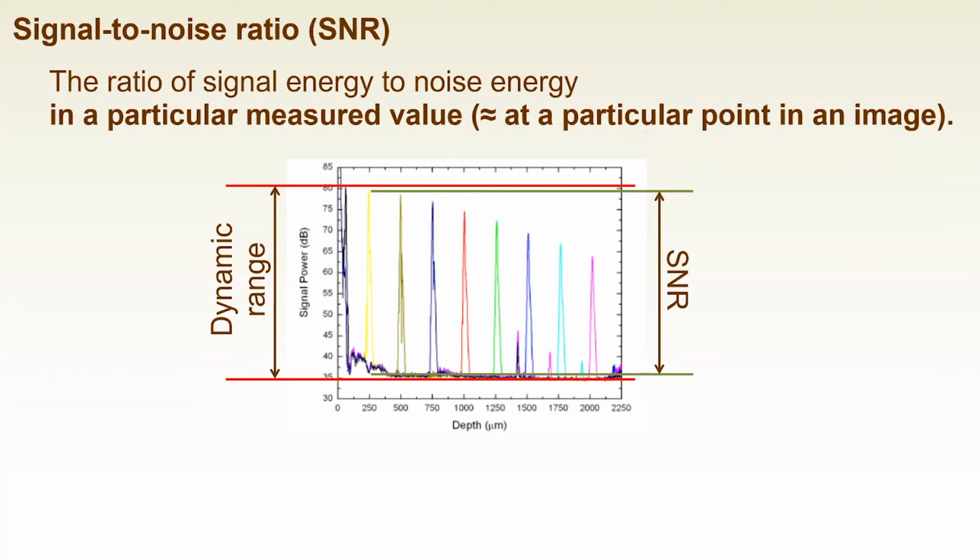in the complex domain. Okay, so the signal to noise ratio, SNR, is defined by the ratio of the energy of the true signal and the noise signal. Noise signal is defined by the variance of the distribution of the noise. That's the SNR. Okay, let me clarify again. Dynamic range is a concept about the image. So at least you need two points to define it, and two of them are realizations.